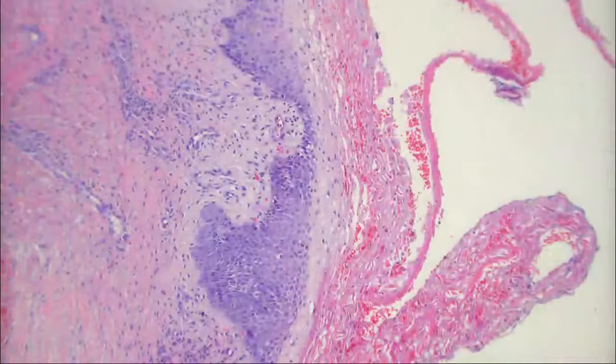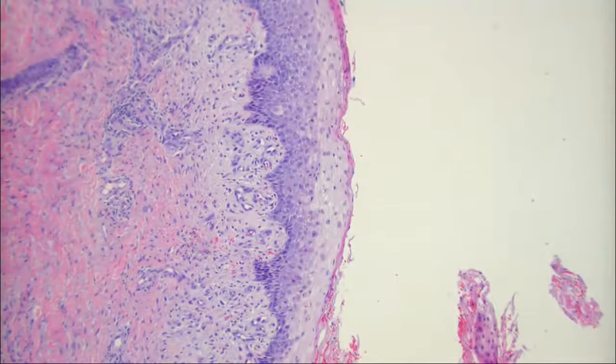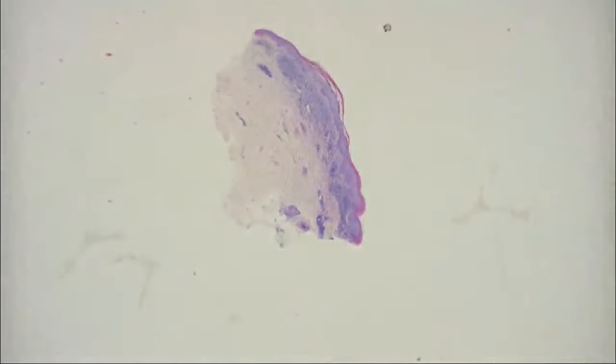Is that like an acquired acrodermatitis? What's another name for that? Zinc deficiency. I'm not sure, but look at the clinical picture. What part of the body is it? Feet. It's acral, yes, or necrolytic acral erythema, associated with hepatitis, right? They all look the same under the microscope. So it's mainly just a clinicopathologic correlation.